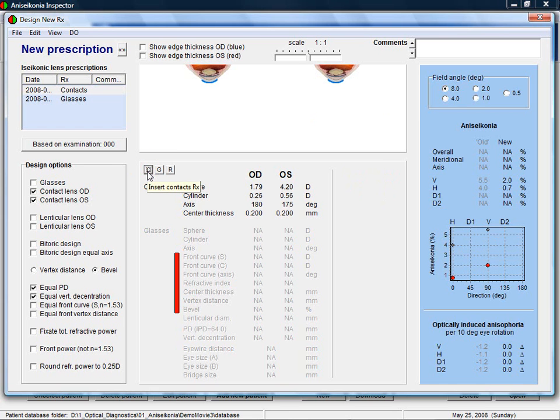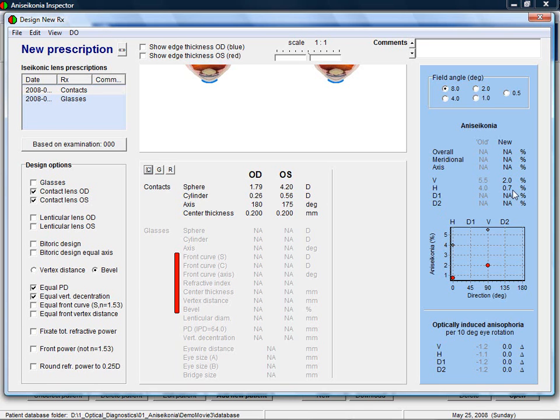Now, the prescription used during the testing has been converted into contact lenses. In this specific example, the aniseikonia seems to be reduced to acceptable levels. An advantage of having only contact lenses is also that there is never any optically induced aniseikonia.